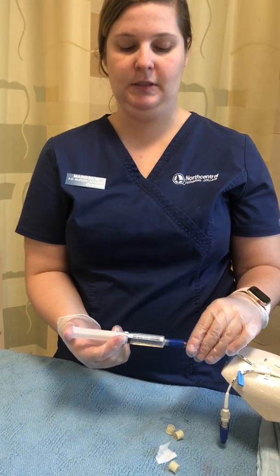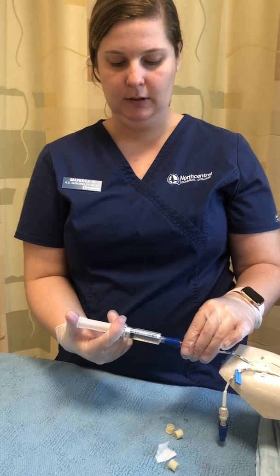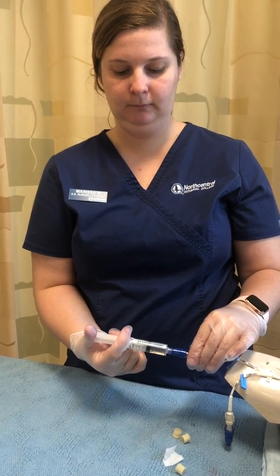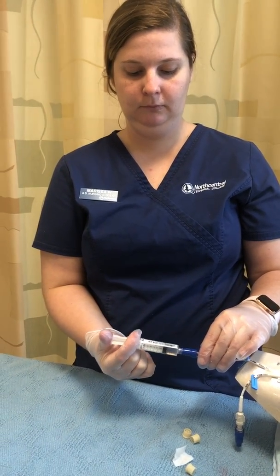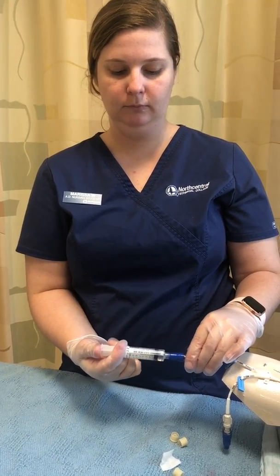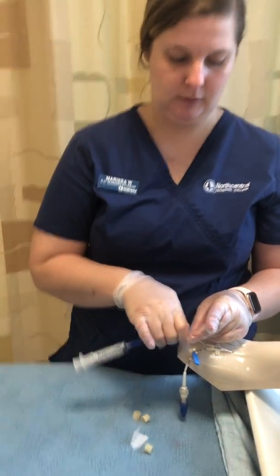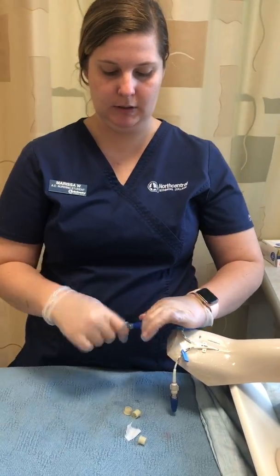And then after the 30 seconds, I would do it in a pulsating motion until my flush is gone. Alright, and then I'm going to reclamp and disconnect.